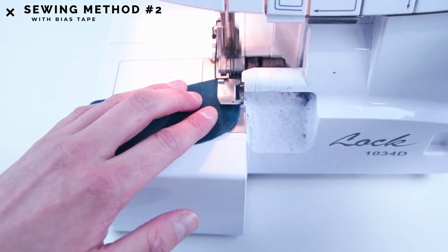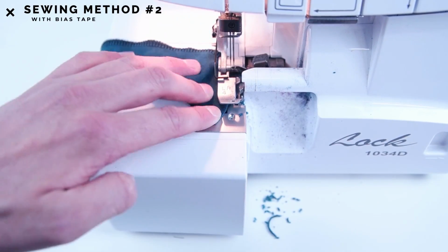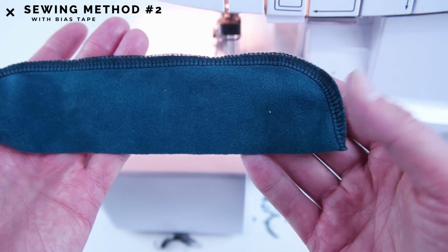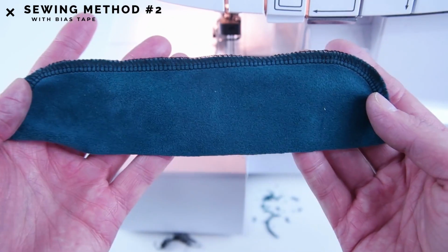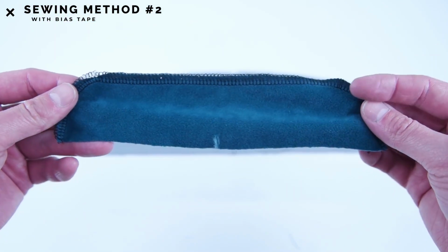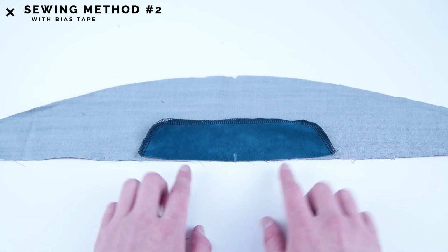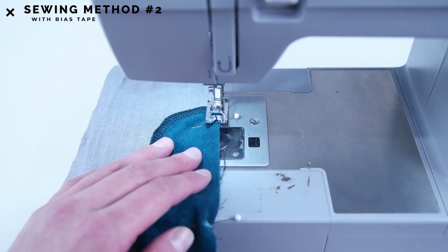Moving on to the sweatband, what we're going to do is serge around the outside edge, or you can zigzag stitch if you don't have a serger. Mark the bottom centers on both the side panel and the sweatband. Line the centers up and sew as close as you can to the outside edge.